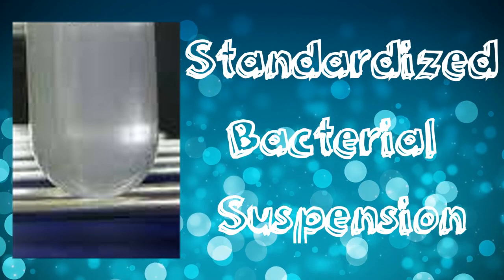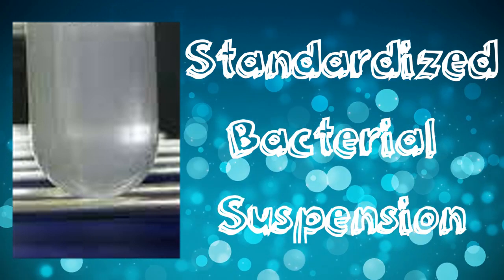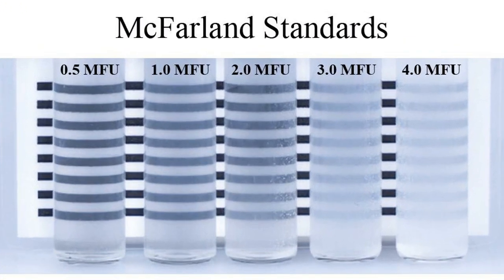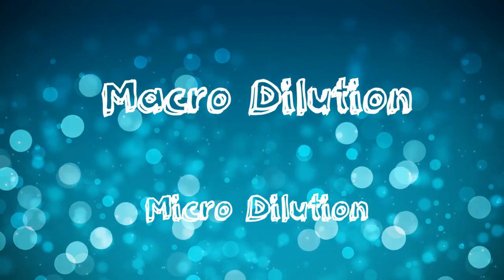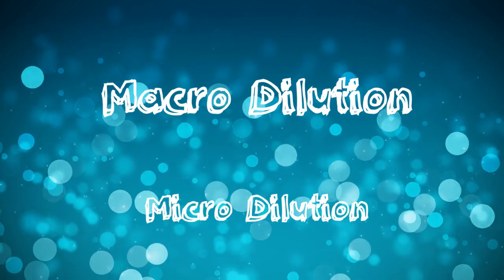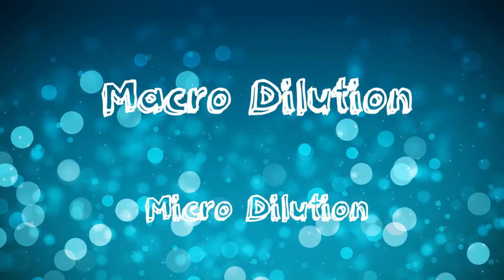To this antibiotic dilution, we add the standardized bacterial suspension of the test organism, matching finally to the turbidity of 0.5 McFarland standard. This broth dilution method can be macro or micro depending upon the total broth volume used. Obviously, the volume will be more in the macro dilution, where we use test tubes with a total volume of 1 ml, and in micro dilution we use 96 well microtiter plate with total broth volume of 0.1 ml.